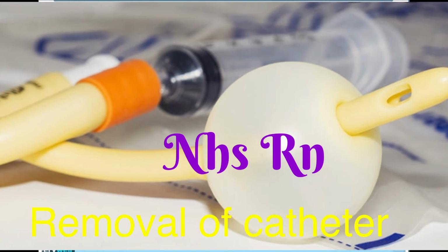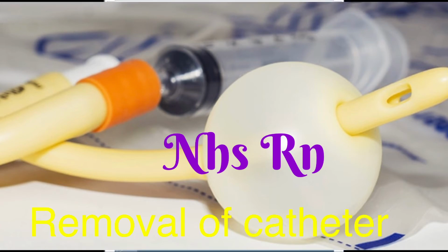Then you put everything, and you need to make sure that a 10 ml syringe, an apron, and a pair of gloves are in your tray. Then always you need to say each item is clean, intact and in date, meaning expiry. All the articles have an expiry date.